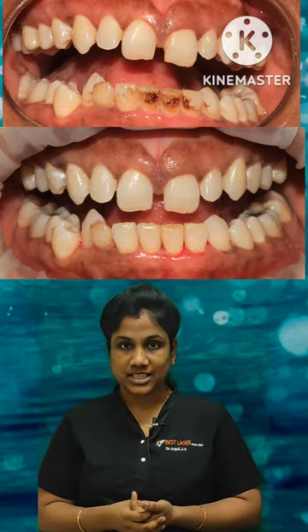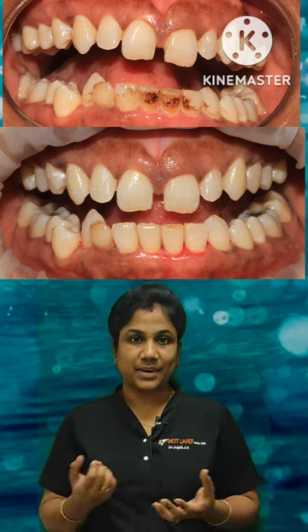After using the air polishing, you can see the result.